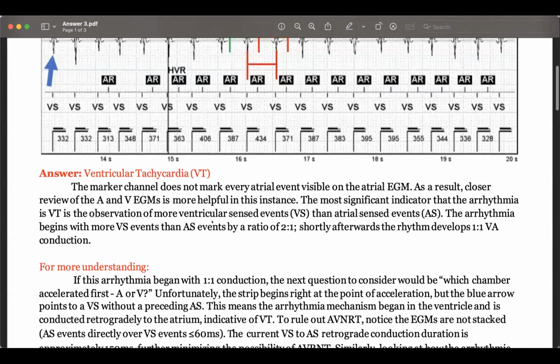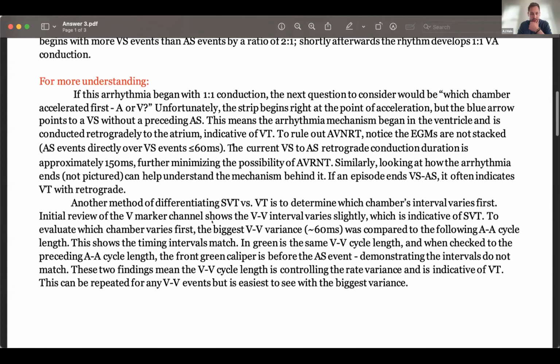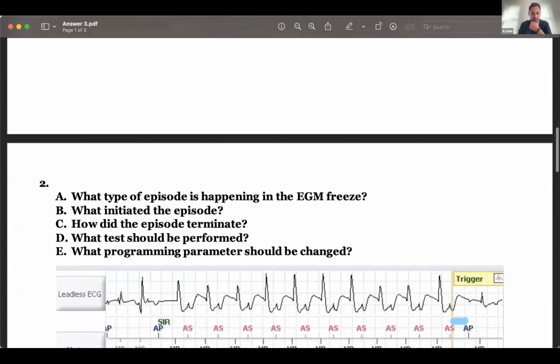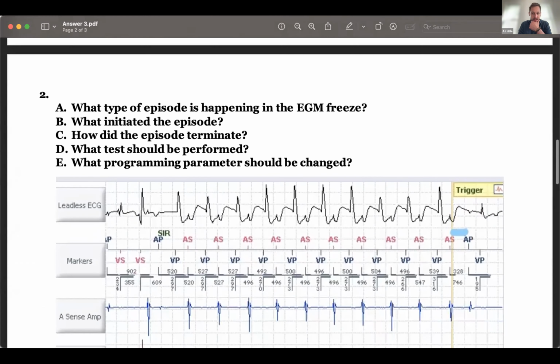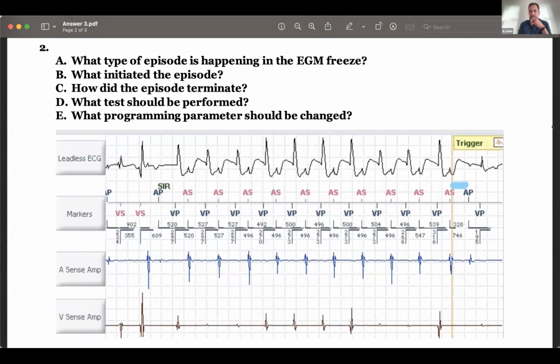So thank you, Dr. Llewellyn. That's a good point. All right, next question. I'm going to try not to spoil this one. What is happening here? All right, so we had somebody who was ready to chime in. I'm not sure if that was you, Elvis, but what's going on in this EGM?